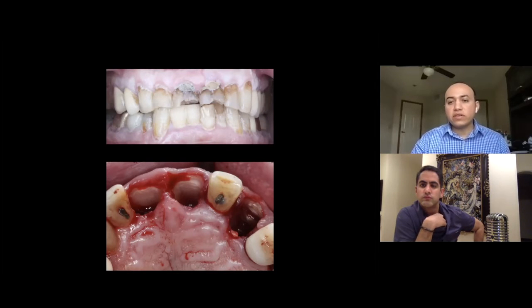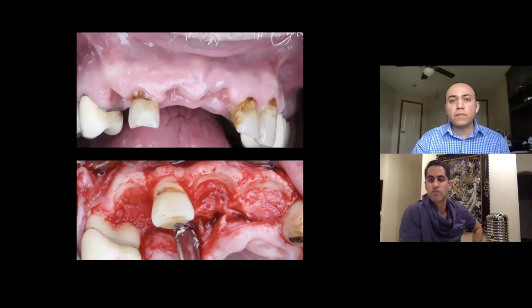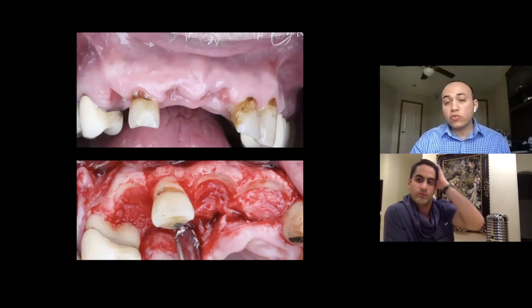And then what happened after I cut the socket shield and was ready to place the implants, I found that the implants go deeper. I used the longest implant I have, which is 16 millimeters, and still the implants are very deep. So I have 2 options here. Either increase the implant diameter and go with a very large implant and jeopardize the success of the socket shield and also have bad aesthetics, or I decide to do a staged approach, which is a 2-stage socket shield. I'm going to first do the socket shield, put the bone graft, and not place the implants till the bone graft heals. So we put the bone graft in, then PRF membranes, and then we went back 3 to 4 months, and then we opened.